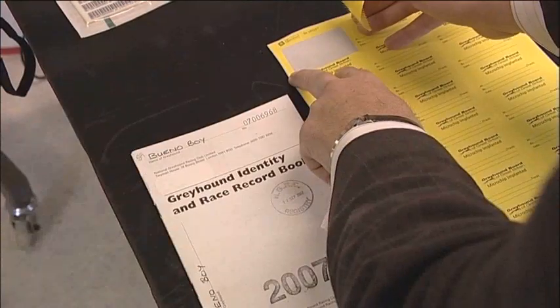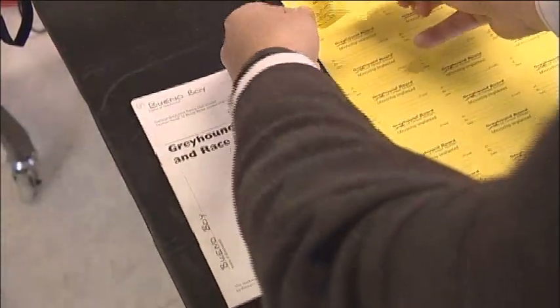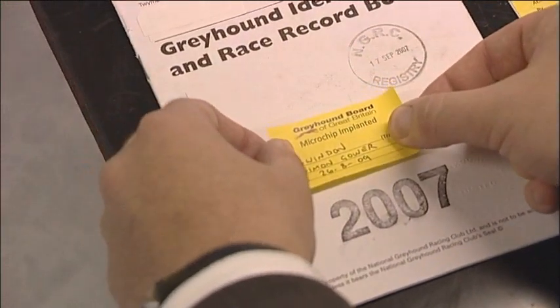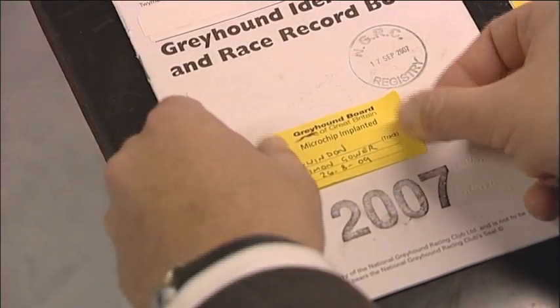All remaining barcode stickers are retained by the stipendiary steward for disposal. Fix a coloured GBGB sticker to the front cover to show the racing office which dogs have been chipped.